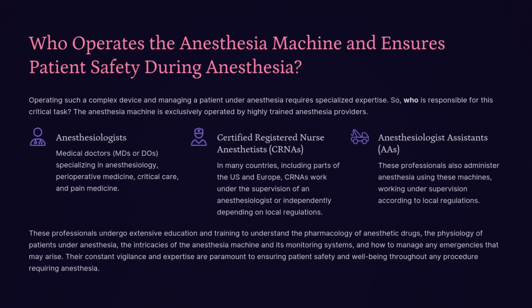Who operates the anesthesia machine and ensures patient safety during anesthesia? Operating such a complex device and managing a patient under anesthesia requires specialized expertise. So, who is responsible for this critical task? The anesthesia machine is exclusively operated by highly trained anesthesia providers. This includes anesthesiologists, who are medical doctors, MDs or DOs, specializing in anesthesiology, perioperative medicine, critical care, and pain medicine.